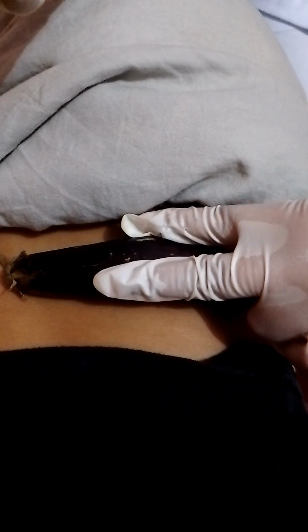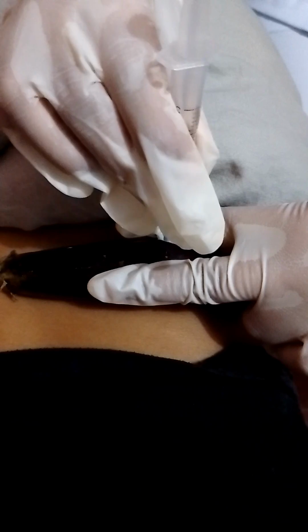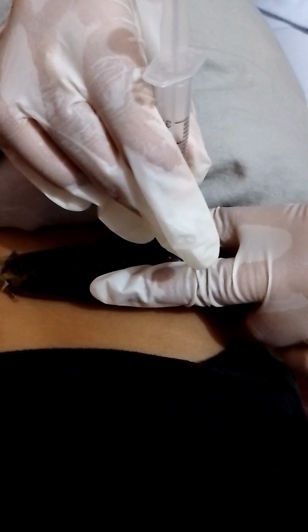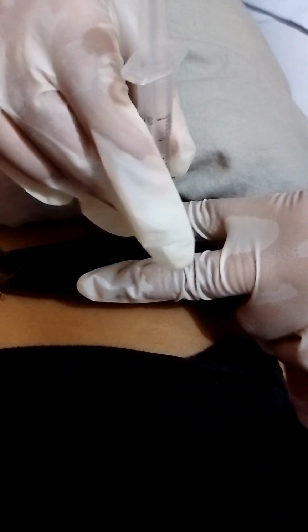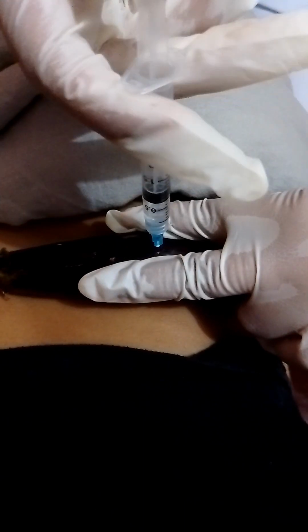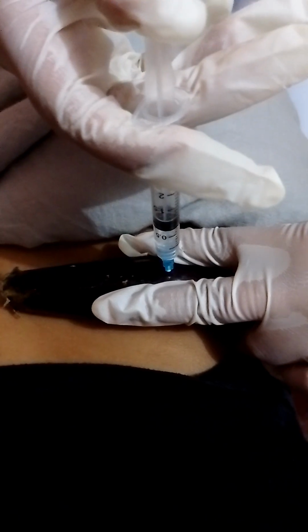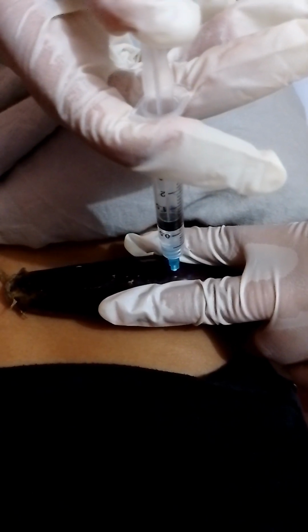This is to determine if you hit a blood vessel. If blood appears, it means you have hit a blood vessel. And now inject the medication slowly at the rate of 1 ml per 10 seconds and wait 10 seconds to smoothly withdraw the needle.